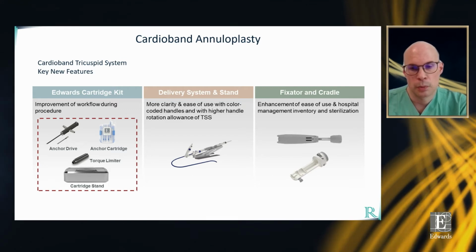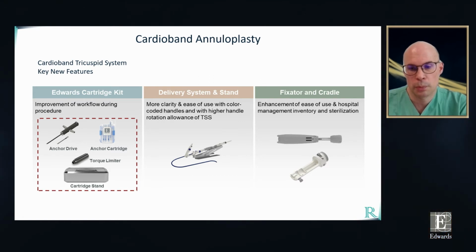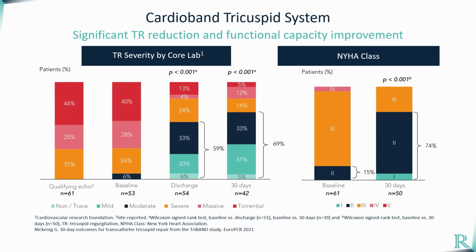This is a little bit easier with the overhauled device. And the fixator and the cradle was improved, which makes sterilization a little bit easier. And so overall, the system was improved. Regarding results, this is actually from the TriBand study.